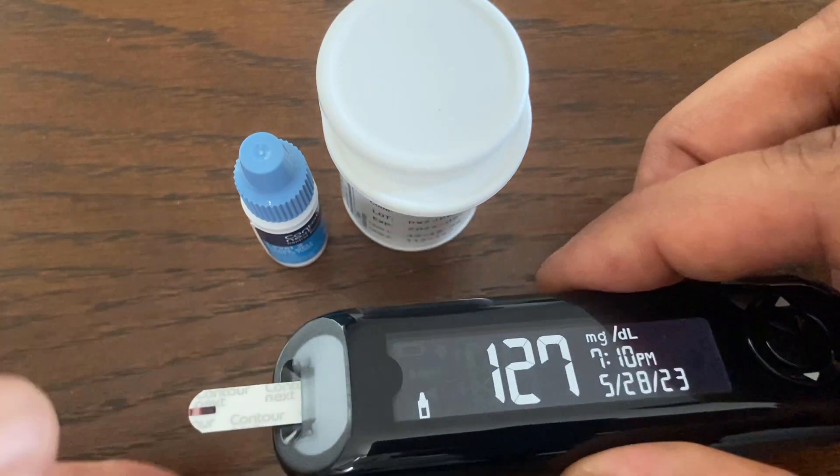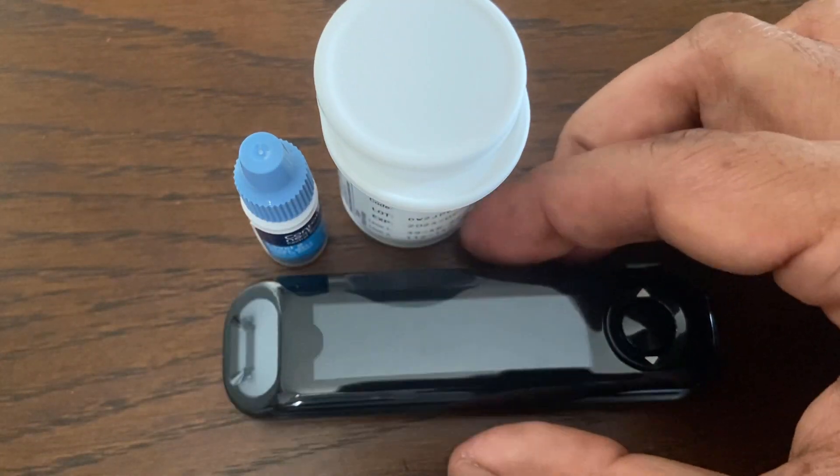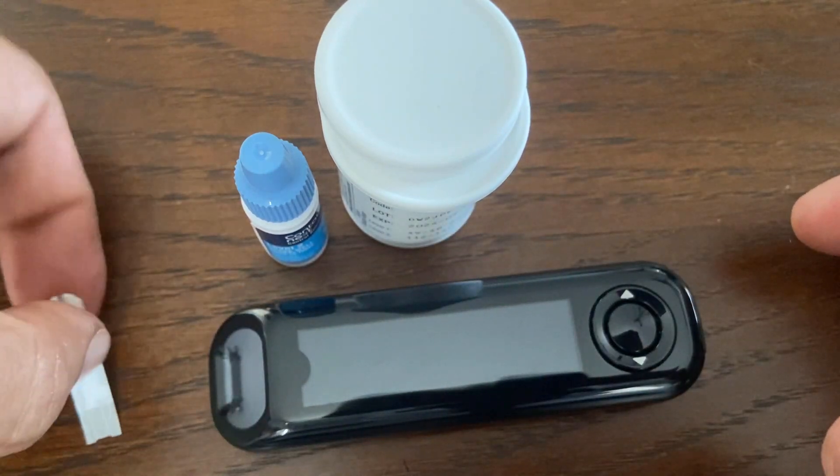If your control test result is out of range, do not use the meter for blood glucose testing, and contact Contour customer service to resolve the issue.